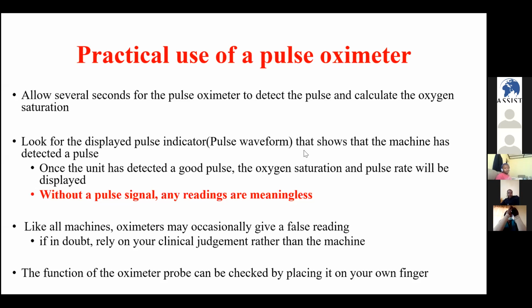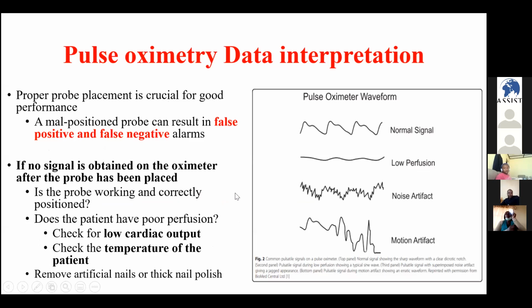Next slide, please. Regarding pulse oximeter data interpretation, you have to properly position the probe to have normal readings.